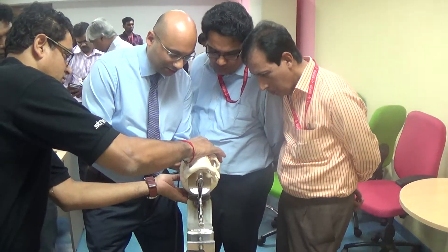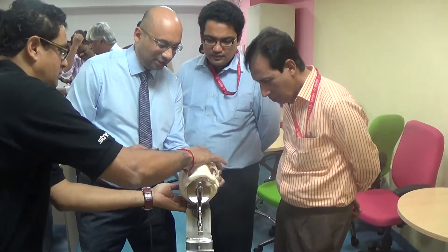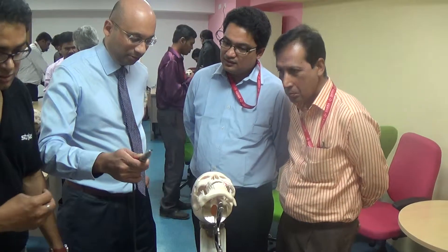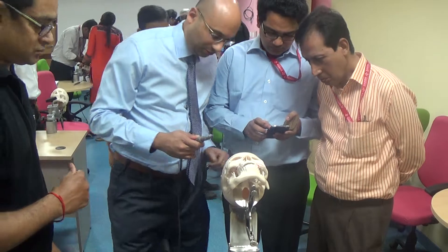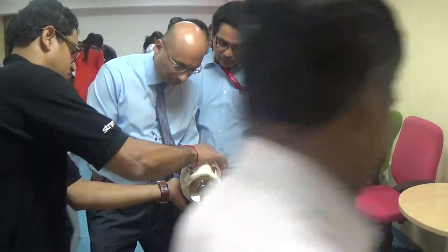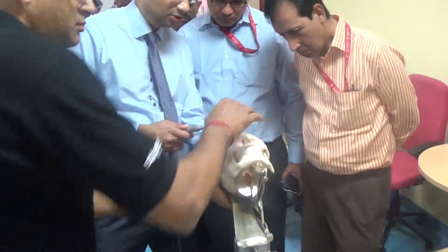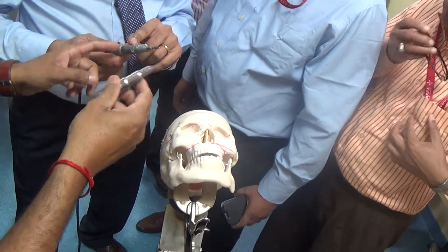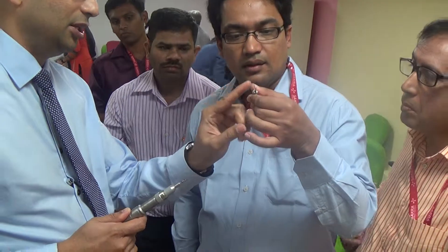They do the same check, and then they use a special guarded osteotome. Do we have the guarded? Yeah. Now that they have made their drills, both of them use a guarded osteotome — that's what this is. This is a neuro guarded osteotome. This guard protects the dura.